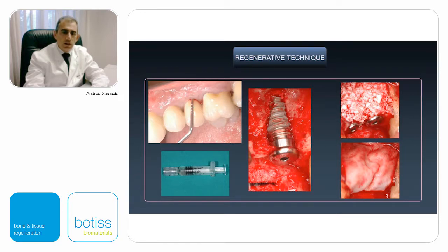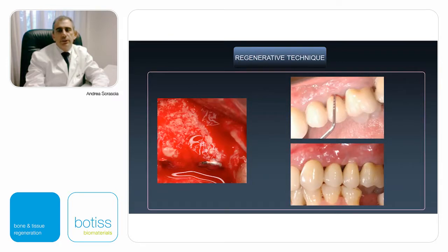During the surgical re-entry to reinsert the crowns, I was pleased observing the positive results that you can see in the left pictures, although we know that it is not an osseointegrative process, but only an ossification process around the implant.